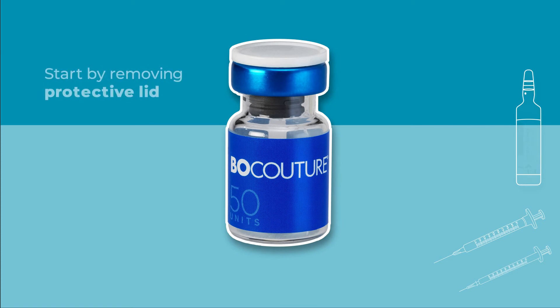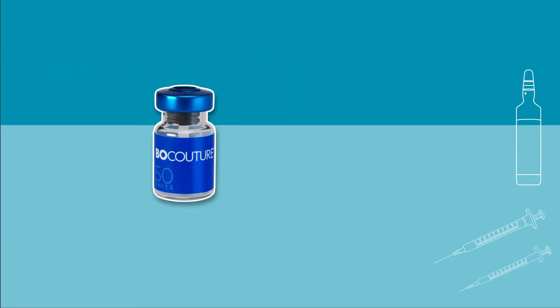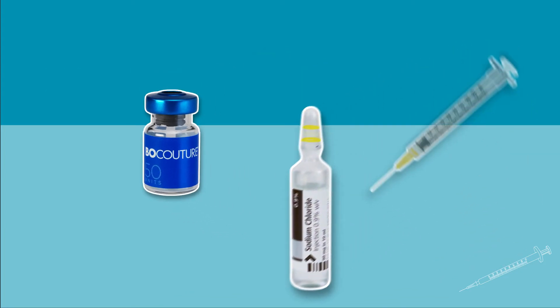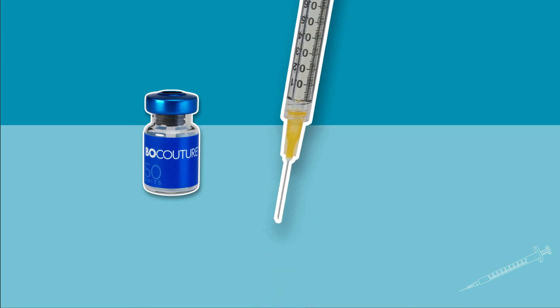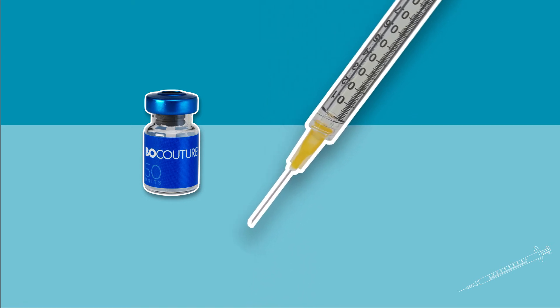Start by removing the protective lid from the vial. Reconstitution and dilution should be performed in accordance with good clinical practice guidelines, particularly with respect to asepsis. Draw up the required amount of sodium chloride solution using a sterile syringe. A 20-27 gauge short bevel needle is recommended.